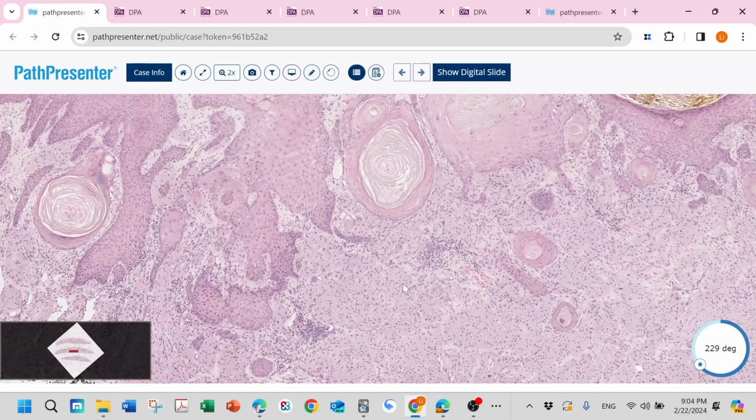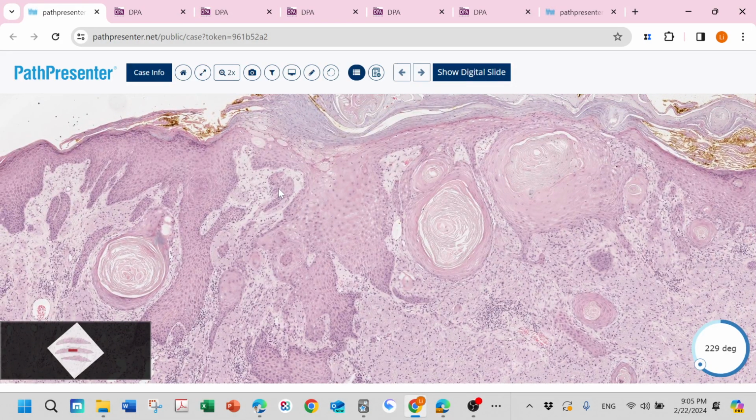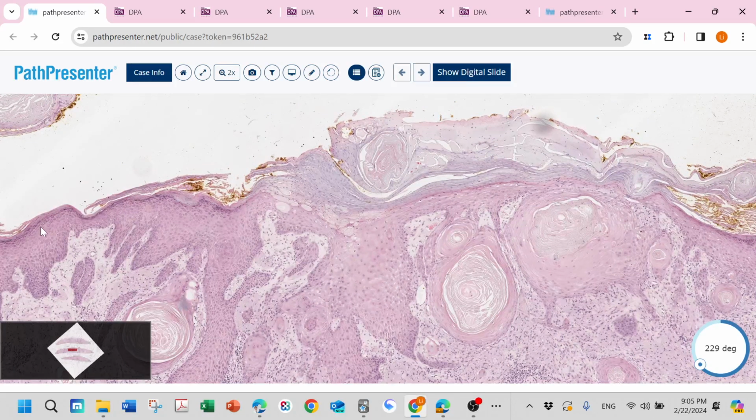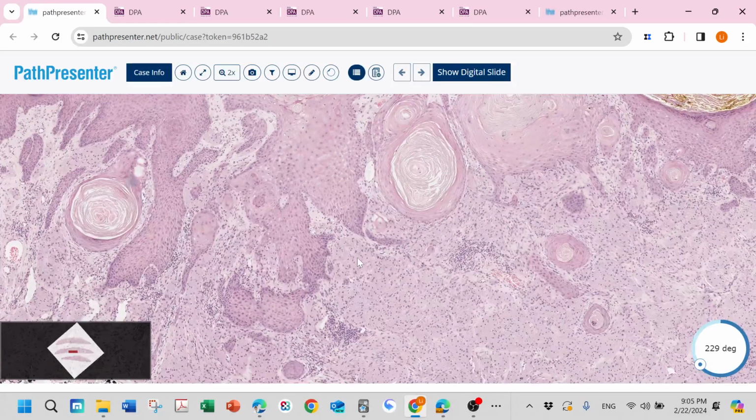And then you can explain this as PEH, pseudoepitheliomatous hyperplasia. This is not squamous cell carcinoma. This is a reactive pattern to the granular cell tumor. But you can imagine if you just have this shape, it would be really easy to diagnose this as well differentiated squamous cell carcinoma. So always pay attention, even if you have a limited sample.